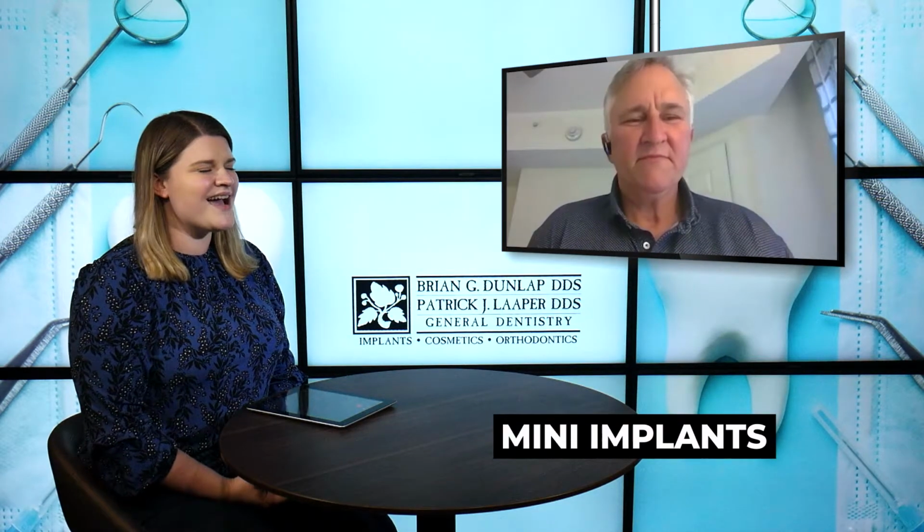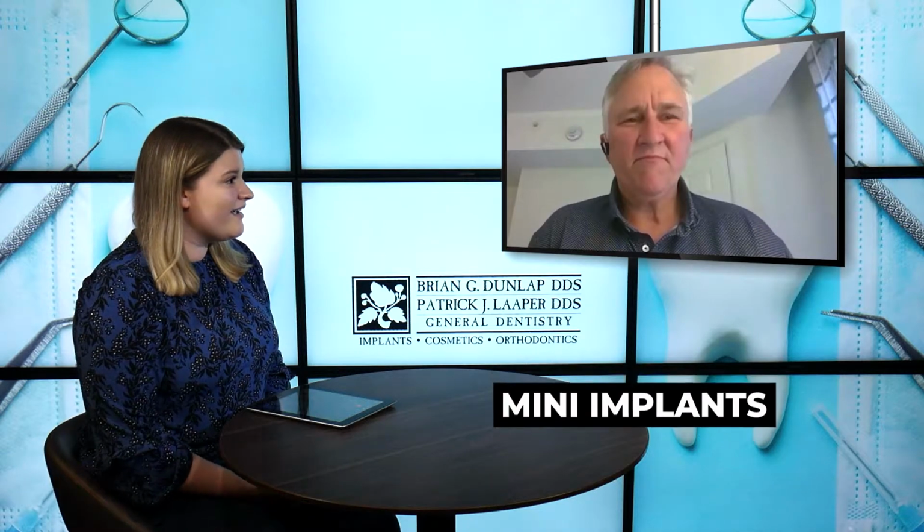So Dr. Dunlap, first I want to ask you, what about them makes them mini? Well, it's the dimension of the diameter of them. I think our traditional implants are usually 3.5 to 6 millimeters wide. These are like 1.5 millimeters wide. So the advantage is you can use them in spaces in your mouth where the bone width isn't quite as wide.